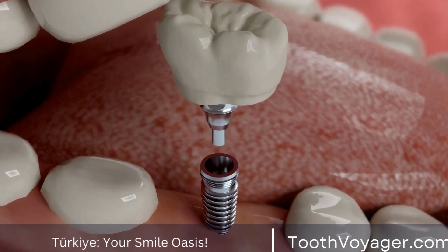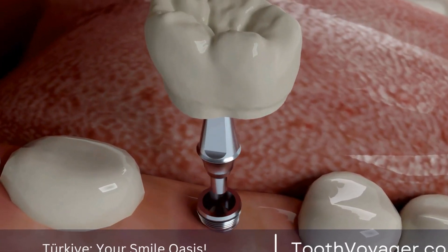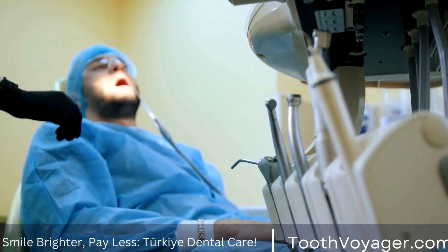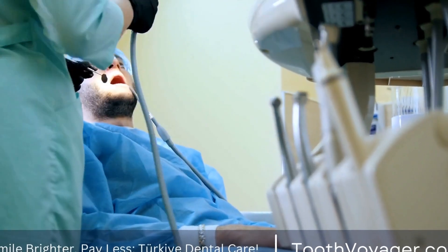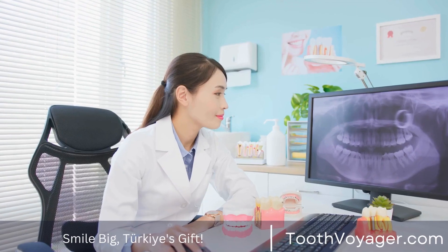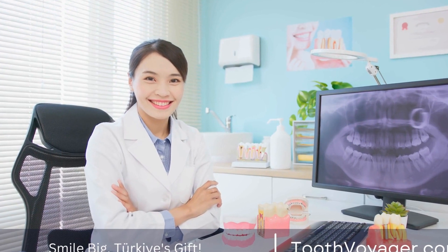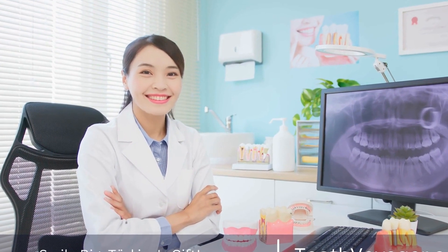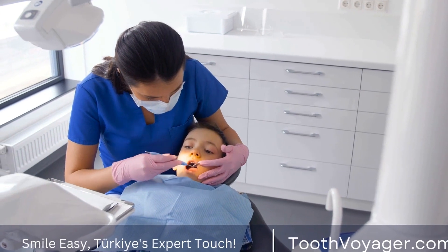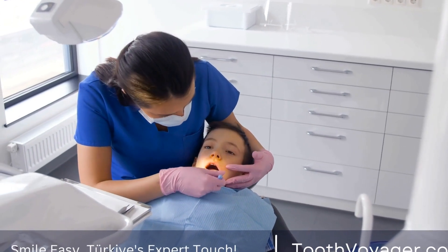Dental crowns are a common dental restoration used to repair damaged or weakened teeth. They are custom-made caps that cover and protect the tooth, restoring its shape, size, strength, and appearance. The process of crafting and placing dental crowns requires a skilled dental professional, precision, and artistry. In this video, we will explore the art of crafting dental crowns, from preparation to placement.